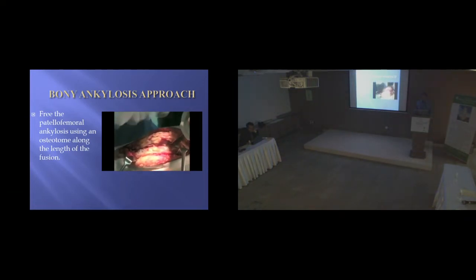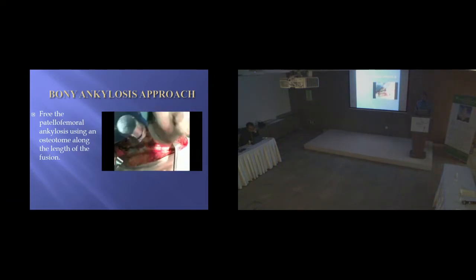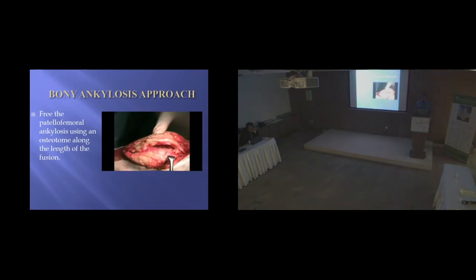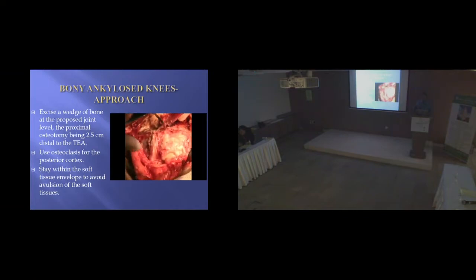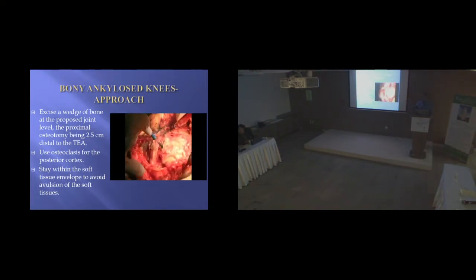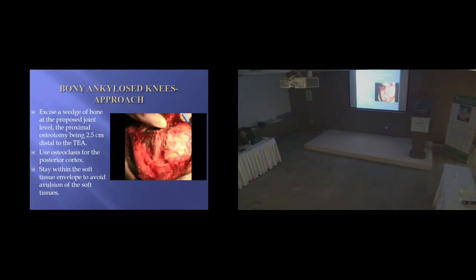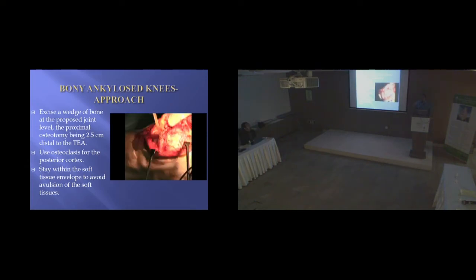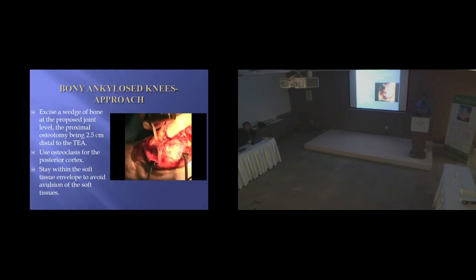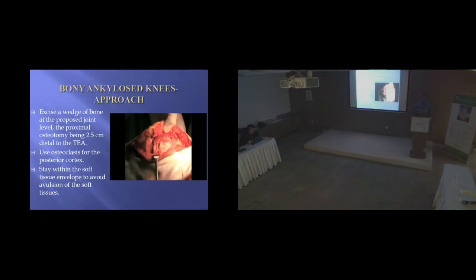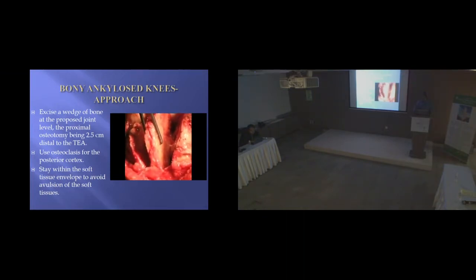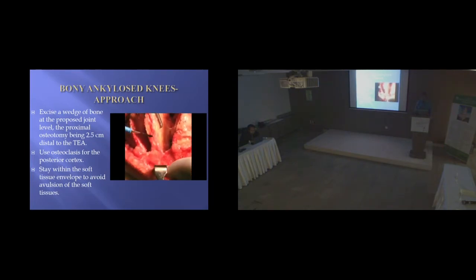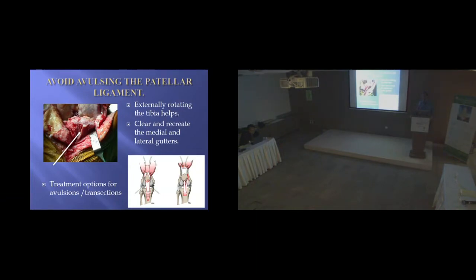This is a video of patellofemoral ankylosis. You take down the patellofemoral ankylosis with a sharp osteotome — this has been done with a rectus snip — and this allows you to evert your patella or at least move it to the side. For complete bony ankylosis between the femur and tibia, make your proximal osteotomy about 2.5 centimeters distal to the trans-epicondylar axis. When using a narrow blade, don't go all the way to the back, particularly in knees ankylosed in extension. Work your way through and take out this wafer of bone, giving you your flexion space and extension space. Try to preserve your collateral ligaments and patellar tendon.